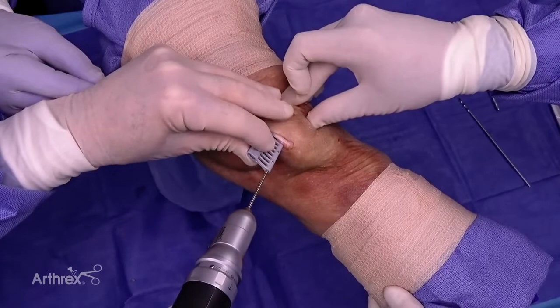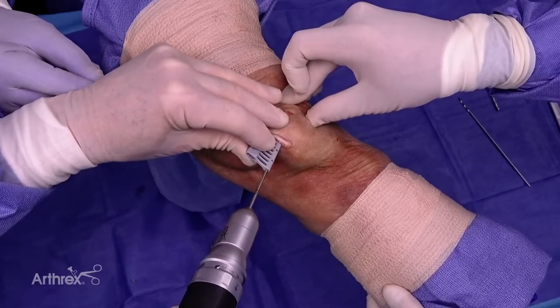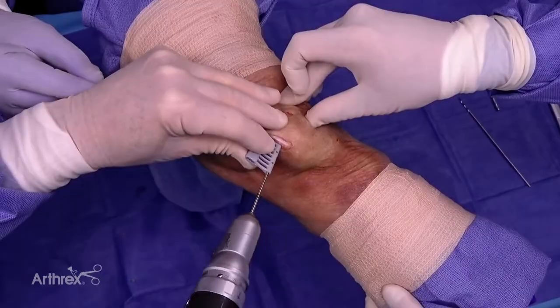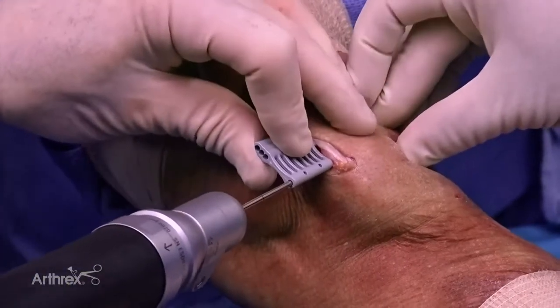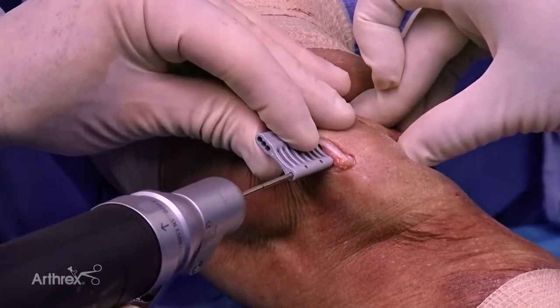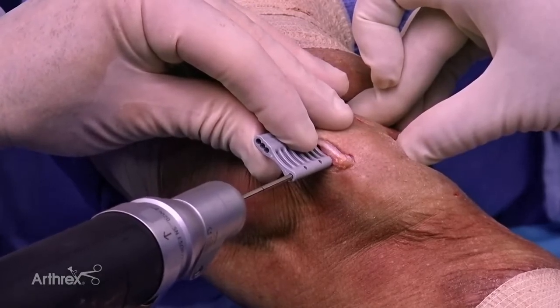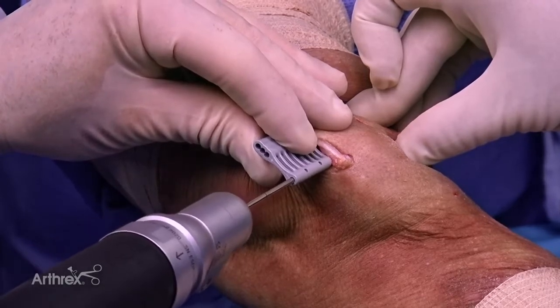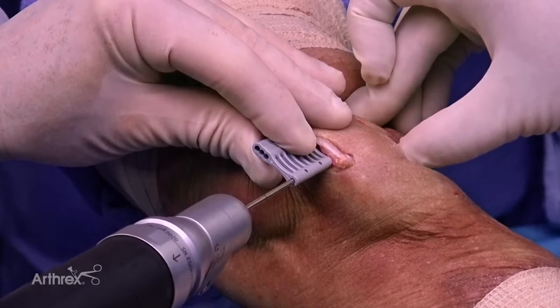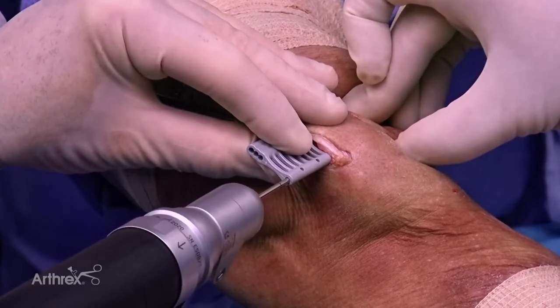Now I'm going to use the angled drill guide and make my first hole for the stabilization of the MPFL on the patella, toward the equator — the mid portion of the patella. With our small medial incision, we bring our guide sleeve down to bone at the mid portion of the equator. From a clinical perspective, it's important to not be too dorsal — you don't want to create a stress riser in the patella which could lead to a risk of fracture. I'm going to put this drill bit down to the black laser line, which will be the appropriate depth for the Swivlock anchor.